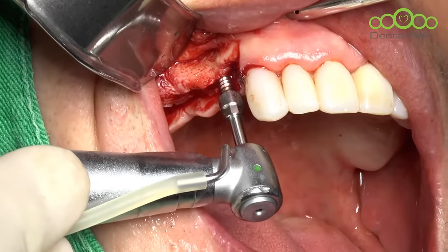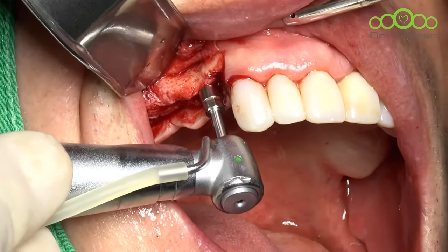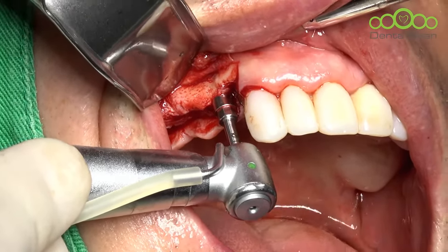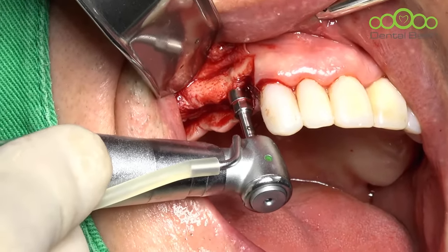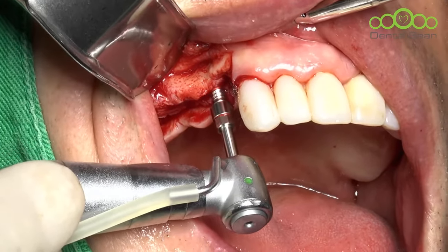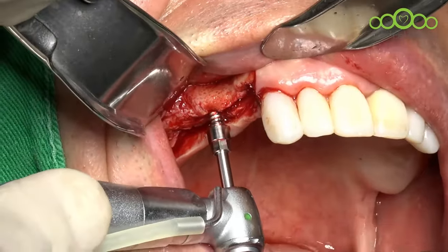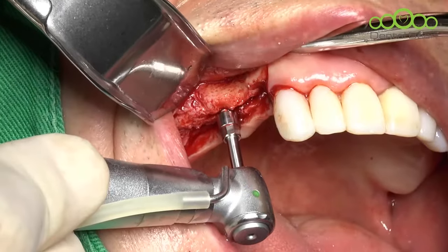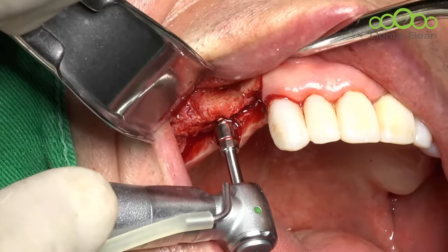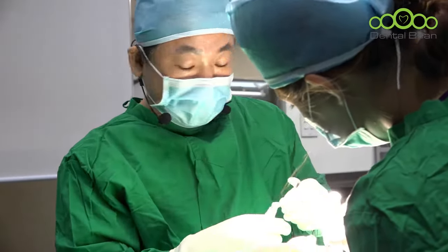This is the set drill. Okay. With forward, and backward. Wait a moment. Okay. Then backward. Forward. Forward. Even though I used a surgical guide, sometimes there's some tolerance in the surgical guide, so the position is not exact sometimes. Forward. Then I'll change to the next set drill.